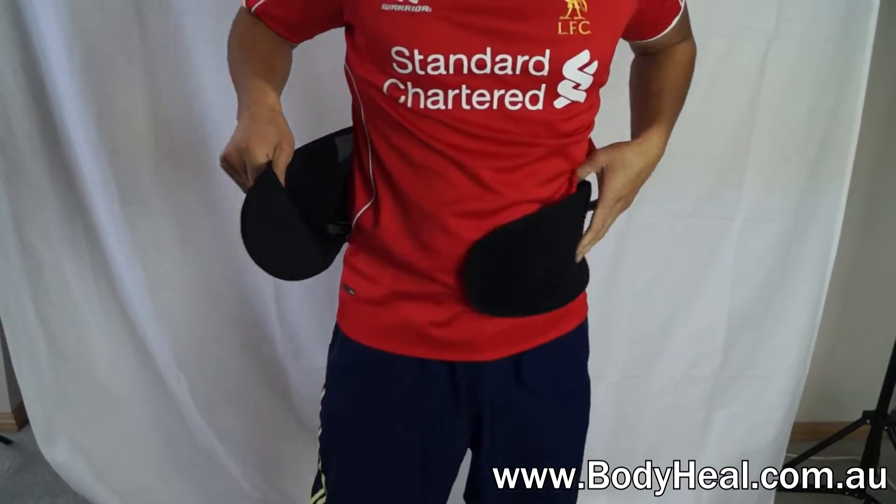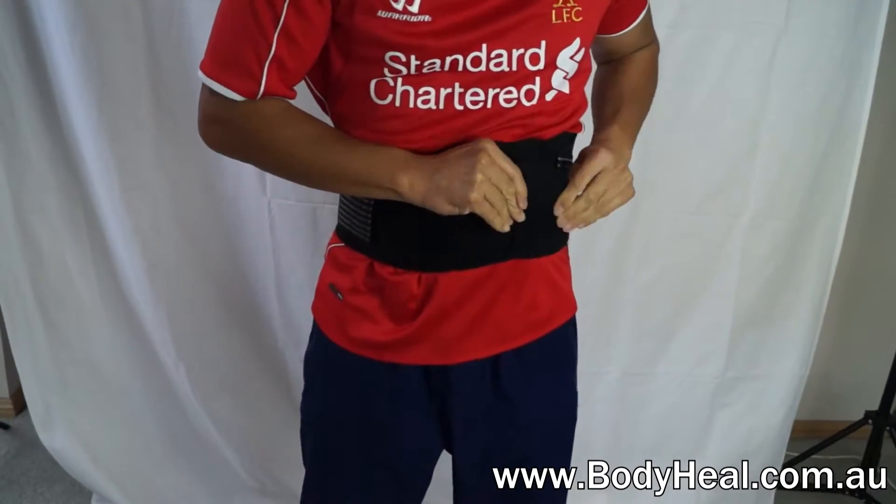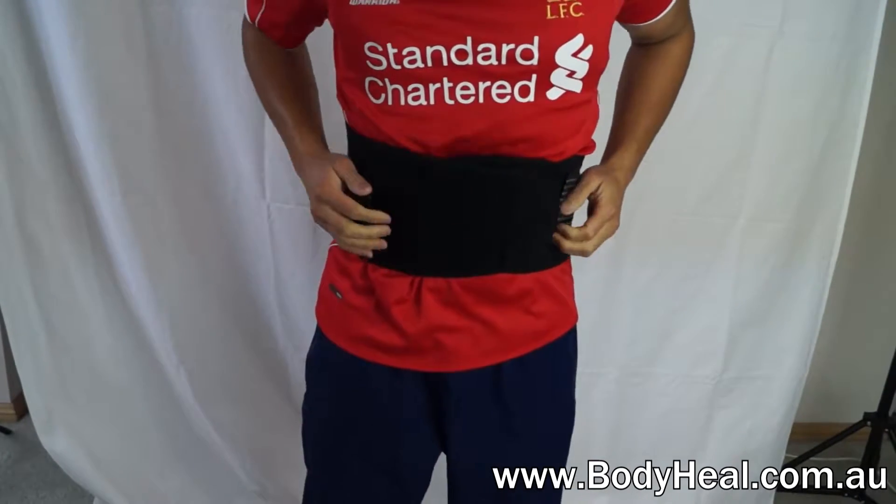You can protect your back with this McDavid Back Support, designed to help with consistent back problems and pain, as well as back pulls or strains.